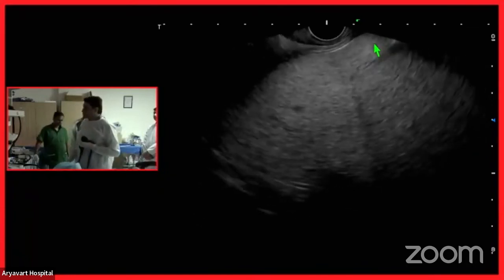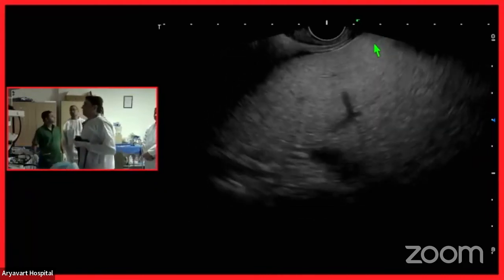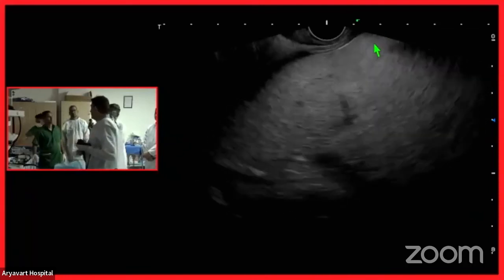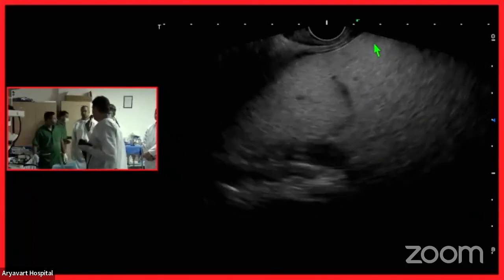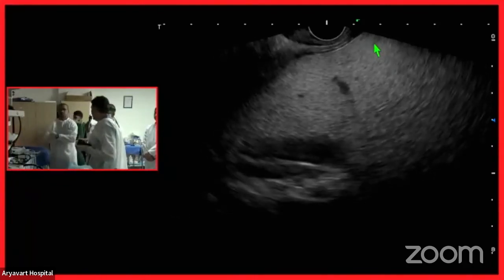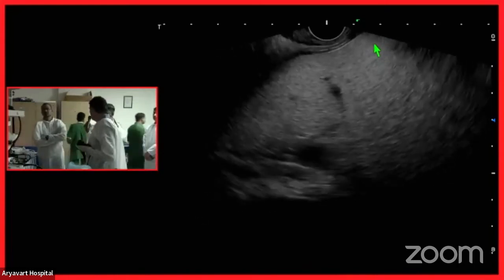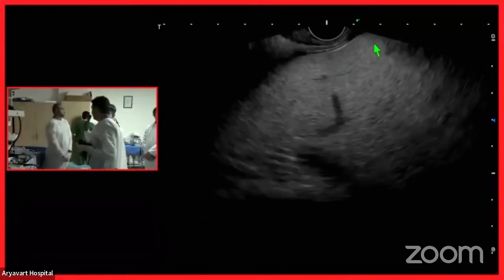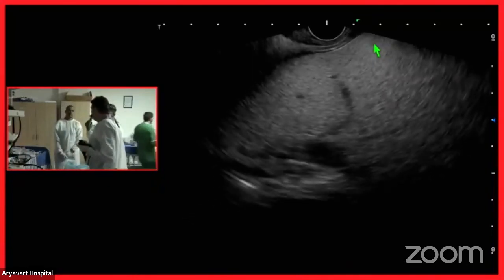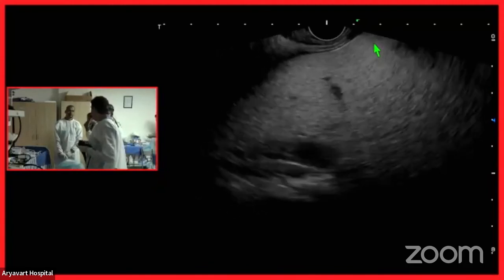My question is, suppose you see bleeding in the track, then what will be your plan of action? What the EUS experts advise is they keep a needle for some time. But for me, because the diaphragm is moving, if you have done an avascular puncture, chances of bleeding can happen anytime. Keeping a needle for 2-3 minutes in a patient who is already at risk because of cirrhosis is not advised because it's moving with the diaphragm.